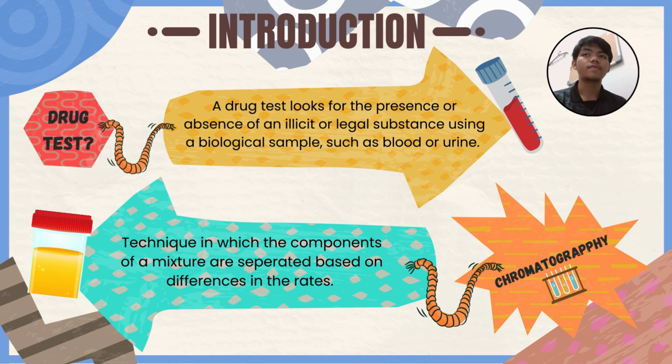Next, we need to know the meaning of chromatography. Chromatography is a technique in which the components of a mixture are separated based on differences in their rates, because every material has its own density, and that is why every material has a different velocity or rate.